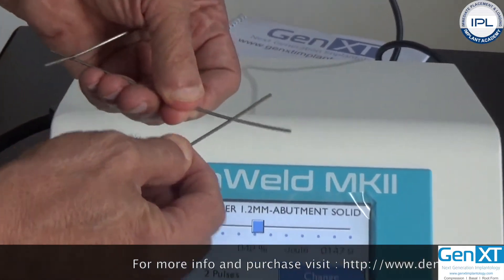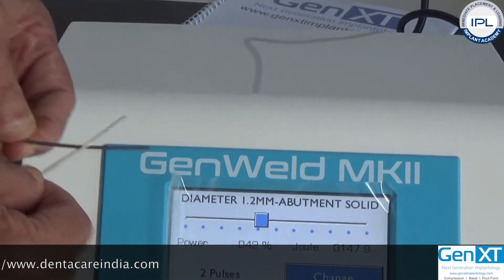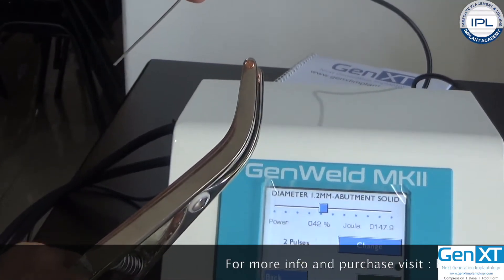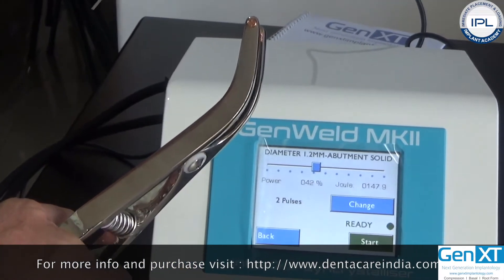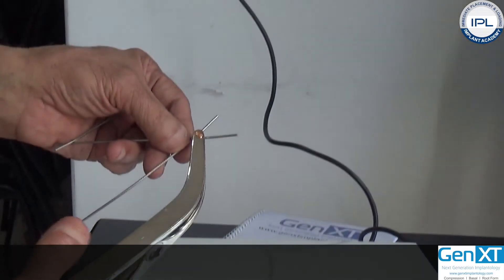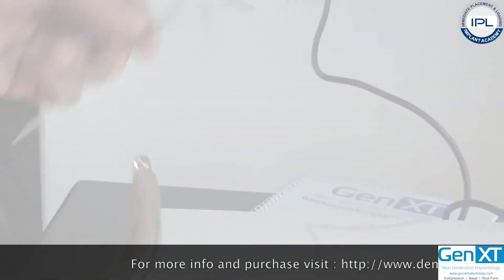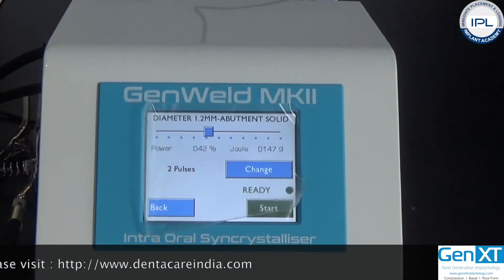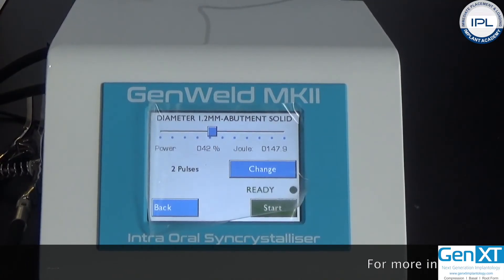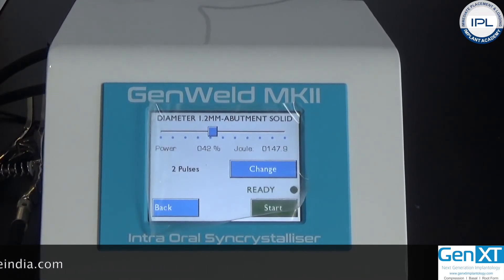It is important that once you press the foot switch, you press it only one time — do not keep it pressed. Just press and release. While the welding cycle is happening, do not try to open the clamp. This was a brief introduction to the installation and use of the machine. For more details, please refer to the user manual of GenWeld Mark II. Thank you.